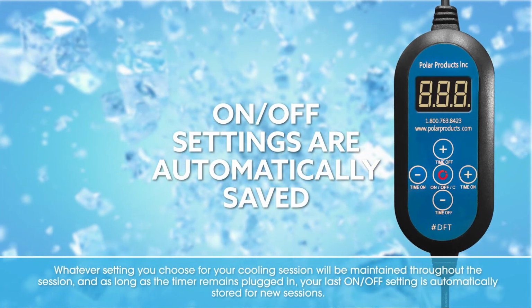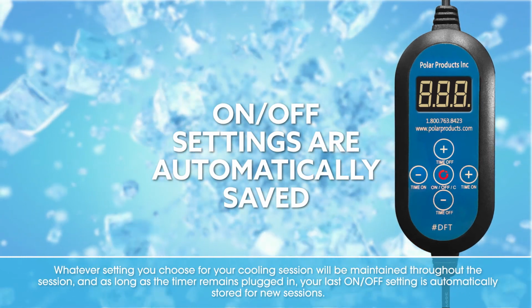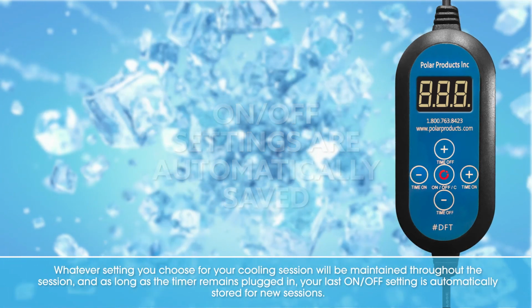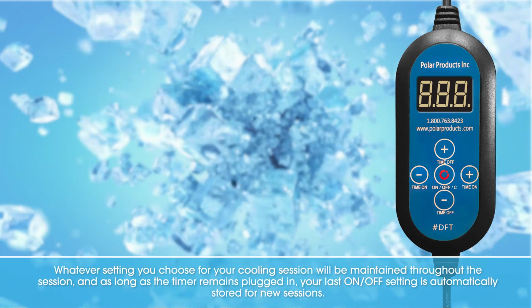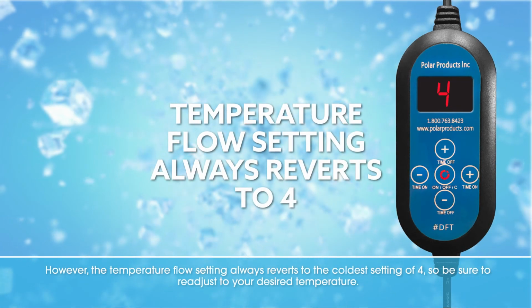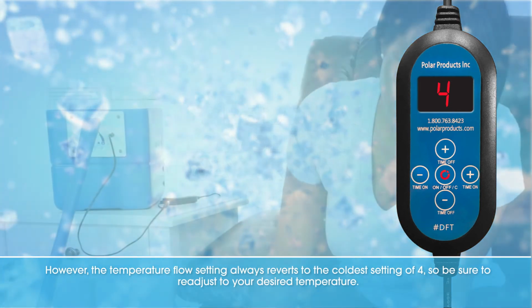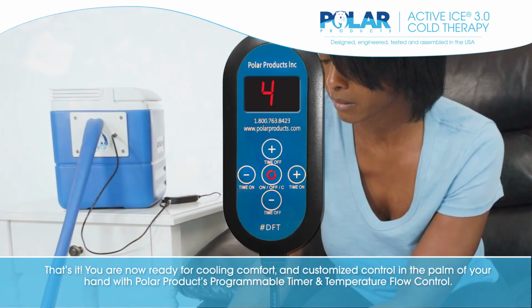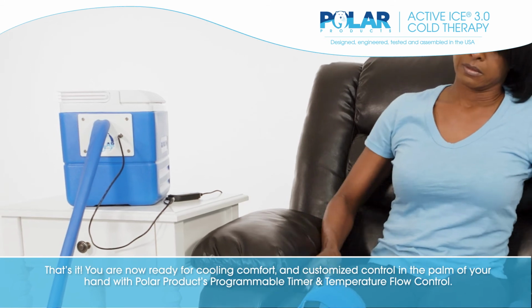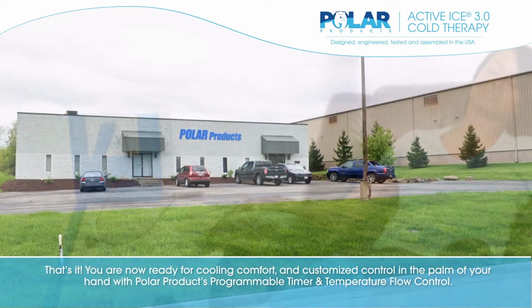Whatever setting you choose for your cooling session will be maintained throughout the session. And as long as the timer remains plugged in, your last on-off setting is automatically stored for new sessions. However, the temperature flow setting always reverts to the coldest setting of 4, so be sure to readjust to your desired temperature. That's it! You're now ready for cooling comfort and customized control in the palm of your hand with Polar Products Programmable Timer and Temperature Flow Control.